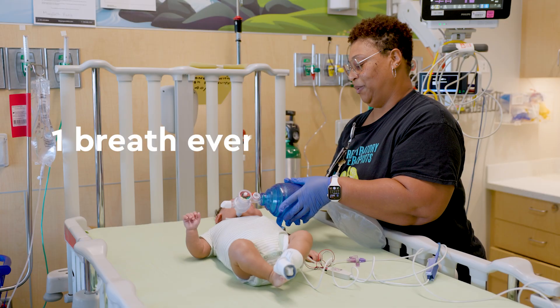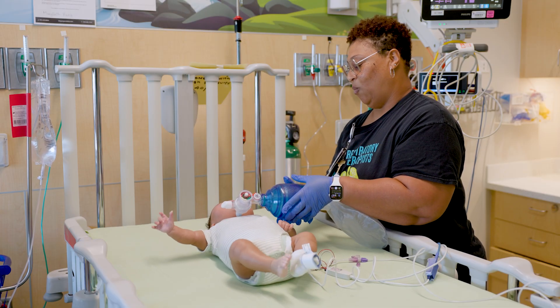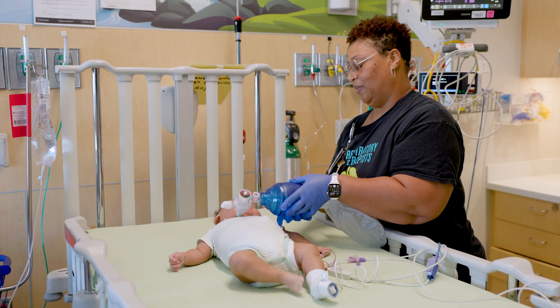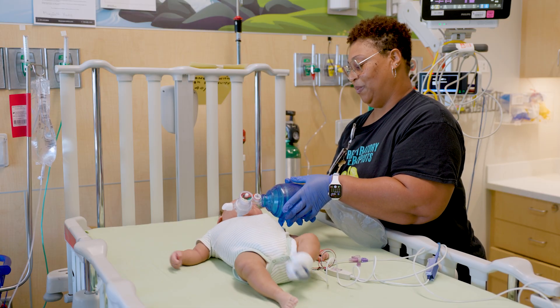Give your child one breath about every two to three seconds, which is about 20 to 30 breaths a minute. Count out loud to make sure you are not giving breaths too fast or too slow.